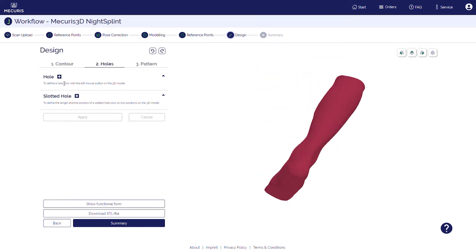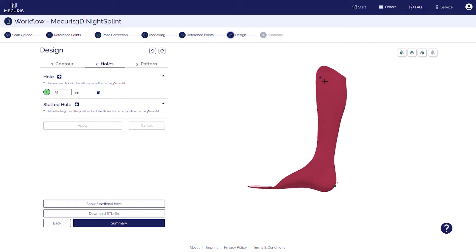In the next step, you can bring in holes and cutouts, for instance in the heel, or slotted holes, for instance for a fixation.